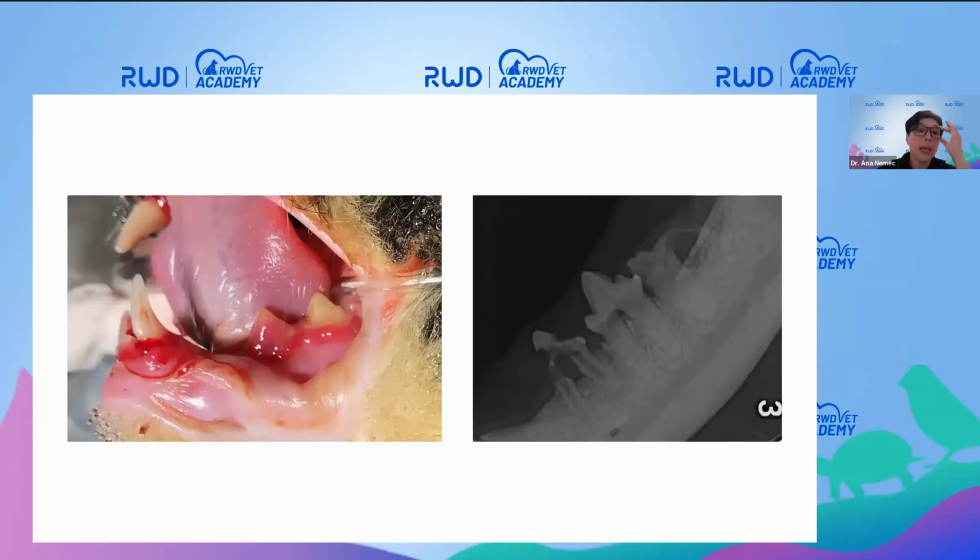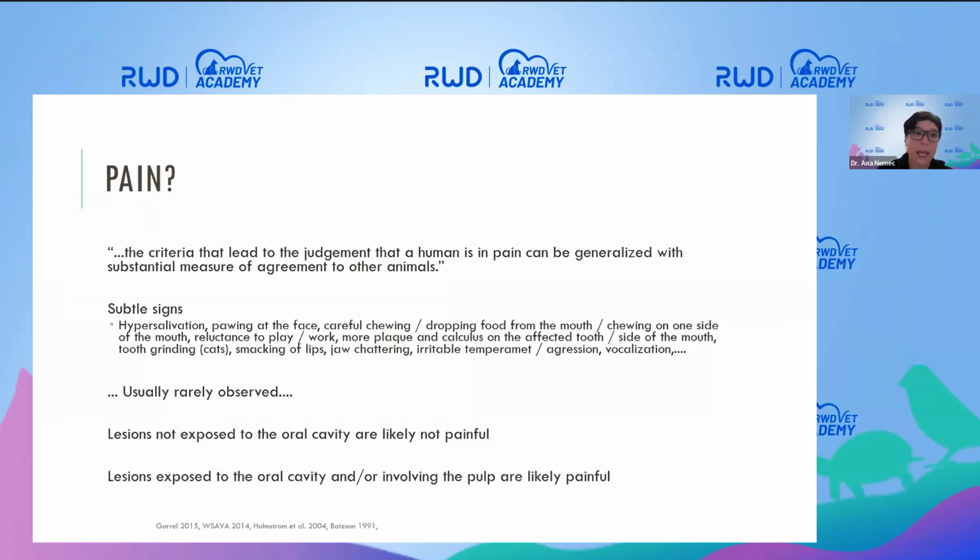It is also true, obviously, that you can see this case, which shows just the opposite. So we have severe tooth resorption of this third premolar in a cat, and we can clearly see signs of endodontic disease in this third premolar. So it's not true that tooth resorption is not causing endodontic disease, but yet it's not that common, or it doesn't happen in all instances like it does when the tooth is fractured. So there is a different mechanism absolutely in place.